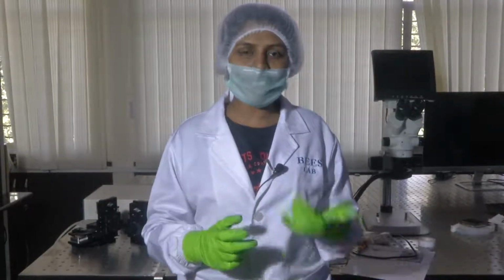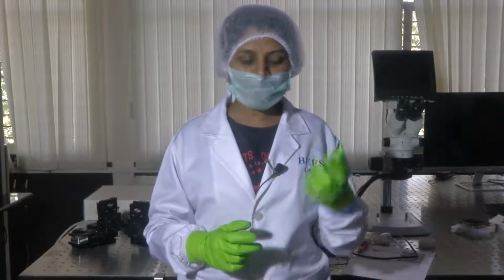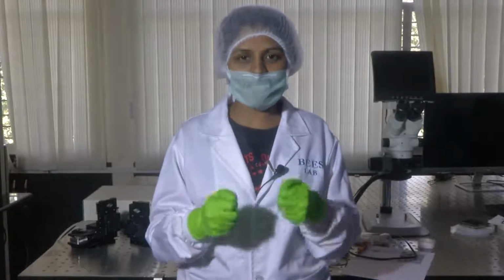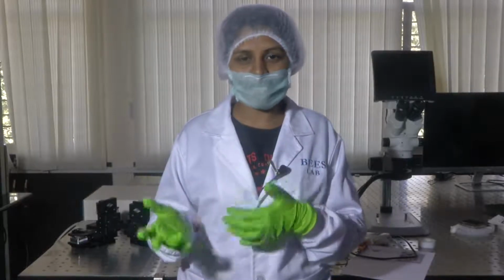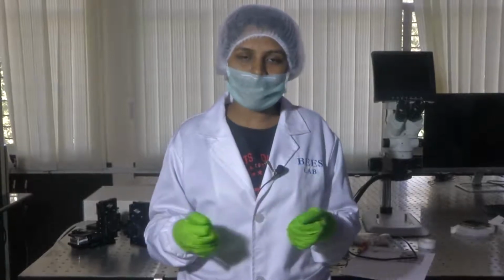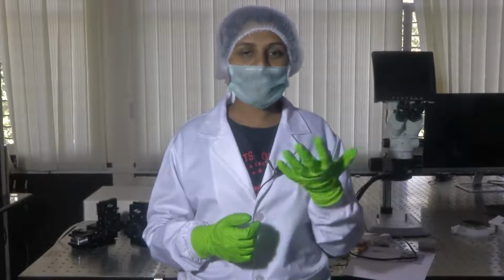Say, for example, let me quote you the usage of optical coherence tomography. When you are talking about studying the elasticity or stiffness properties of tissues, it comes under elastography studies. So when you say elastography, it is nothing but the study of elastic properties of tissues. And like I was mentioning, we use OCT.